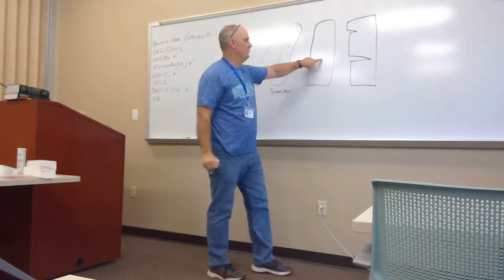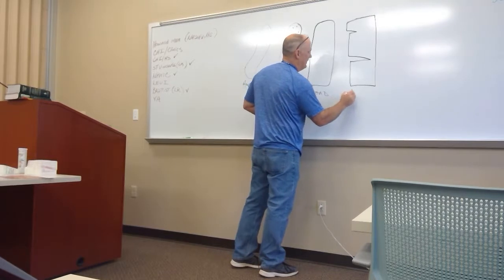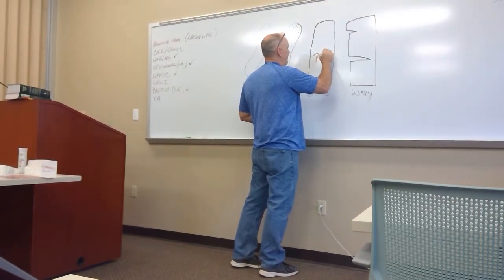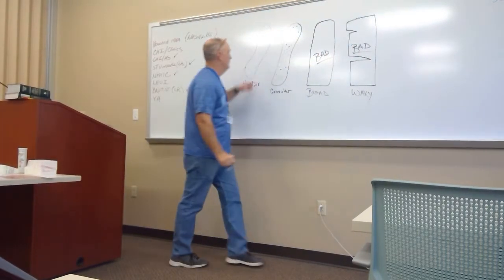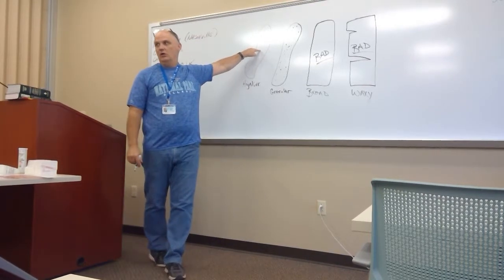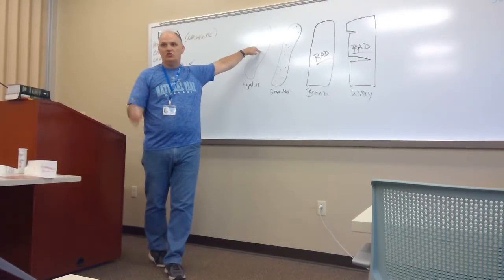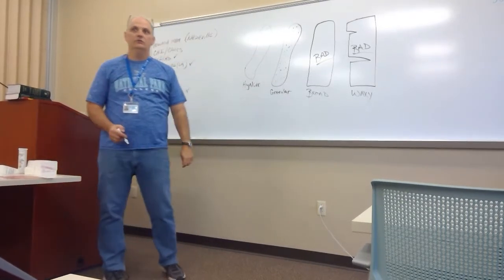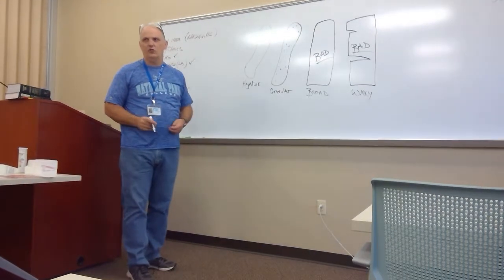Okay, this one, the broad cast, the waxy cast. I just want you to think of these as bad, bad. All right, bad, bad. This is actually normal. You can see this in somebody that's just been exercising. It'll tell you that in your book. Somebody that's just come from some sort of strenuous exercise or something, you can actually see a hyaline cast in the urine. I think they say 0 to 2 per low power field is considered normal.